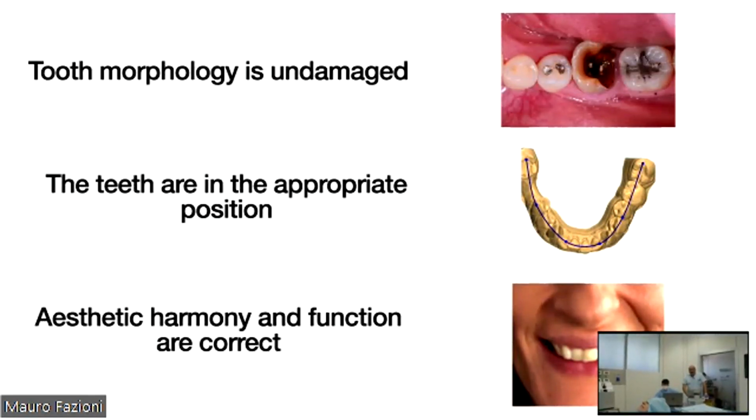This is our best practice. It's very common for us to do one-day dentistry, a one-day solution for the patients.